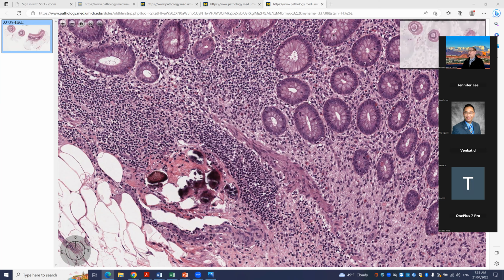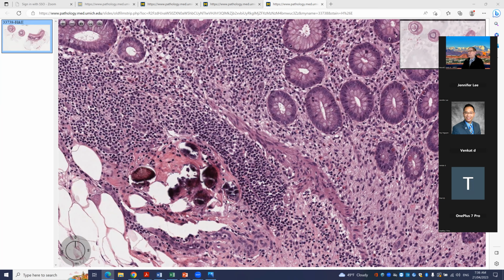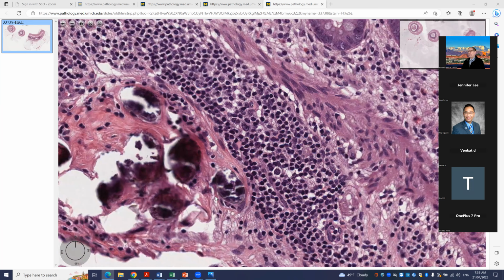Yes, Sahar says they're old. Yeah, they are old. These have been there a long time, and that's why they've calcified. But I think even the very fact that they're still here calcified, and you can identify the shell, this outer membrane of the organism, without much in the way of response, is a very intriguing question.